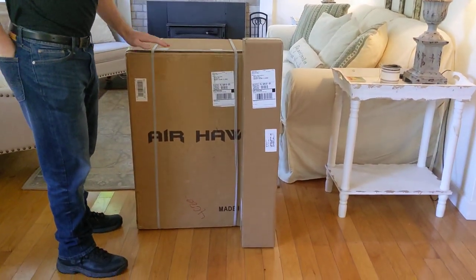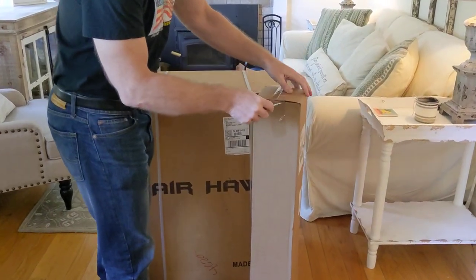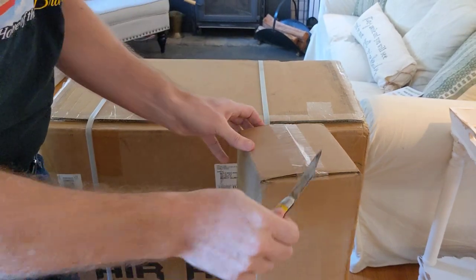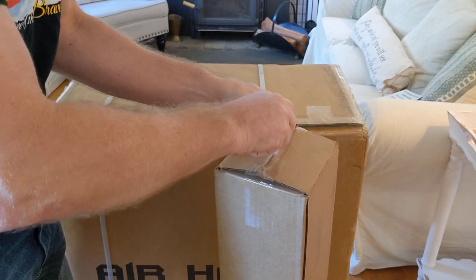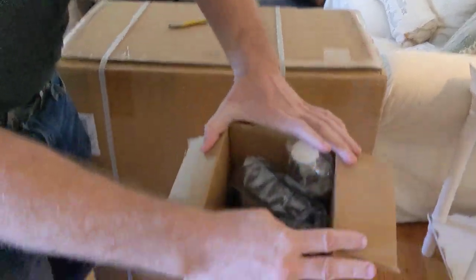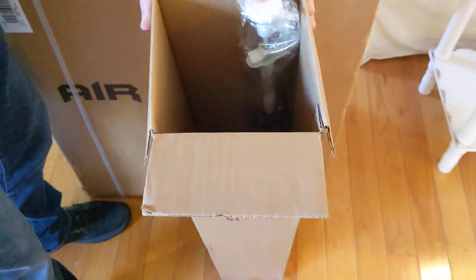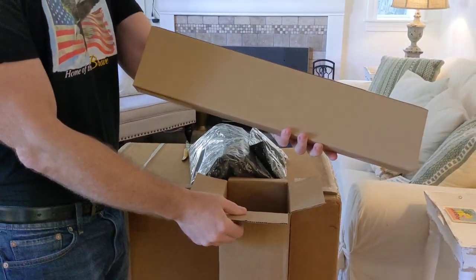We've got the accessory package and we've got the actual chair package. I'm not going to get all the accessories out, but I want to point out a couple of things. The accessories come in this little separate box that you would sometimes get a day or two before or after you get your Airhawk — it just depends on what part of the country you live in. Everything is packed in here, and of course we have the second battery itself in the accessory package.